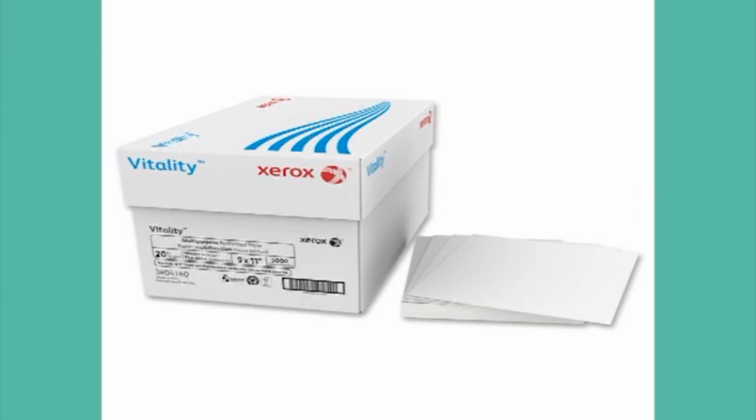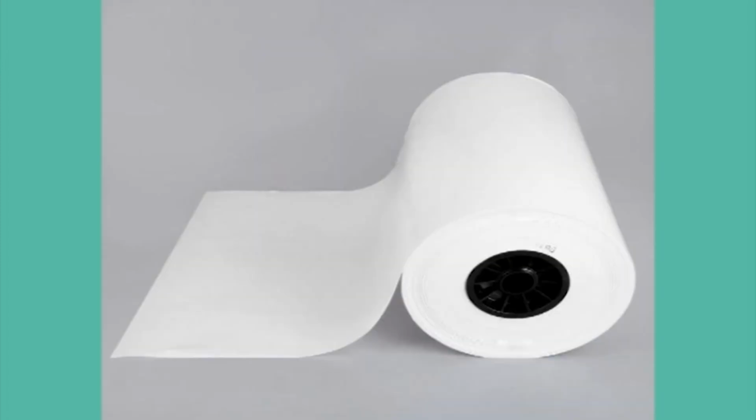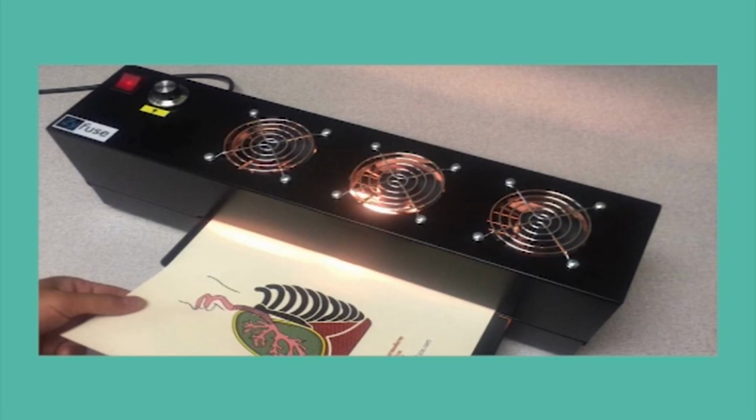Cut sheet paper is pre-cut and does not have tractor feed edges. Rolls are used mainly for high capacity printing. There is also swell form paper which is used by graphic embossers.